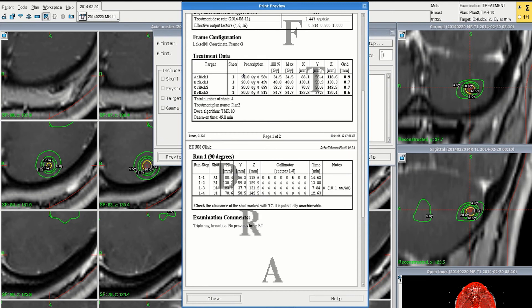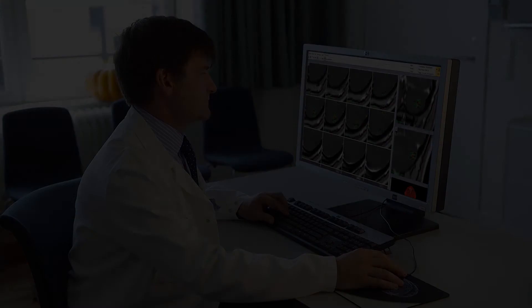Finally, we can check the treatment protocol. This shows the prescription dose for each lesion, the overall treatment time, and the individual isocenter settings.